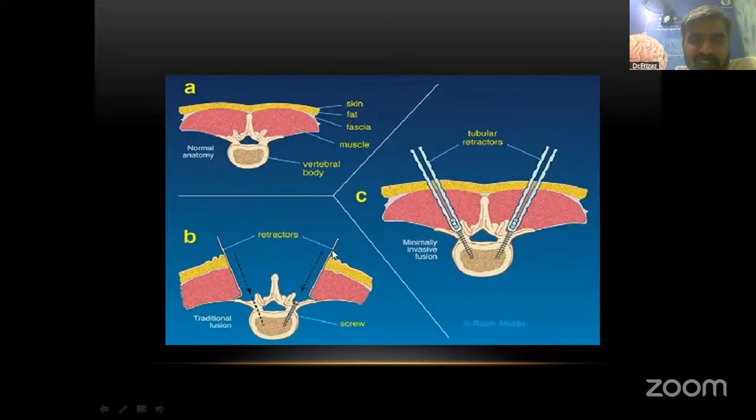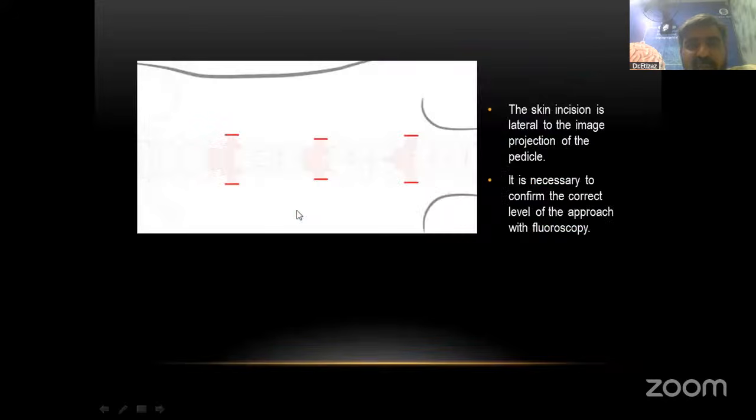So this long retraction is now being completely or partially transformed into minimally invasive, less destructive surgery, whether brain surgery or spine surgery. So this picture is important when comparing open and minimally invasive surgery.